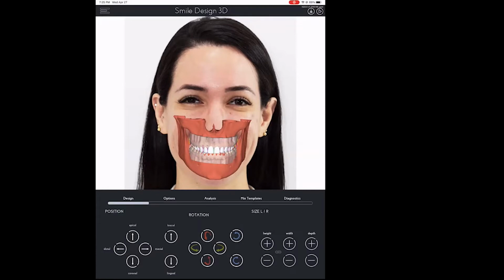Okay, so I see here 70% of you guys don't perform your dental wax-up trials yet. 33% of you guys do perform your wax-up trials. That's great.